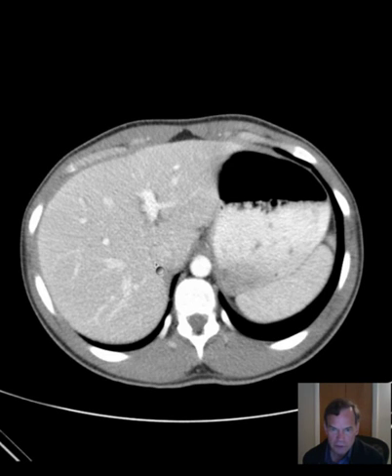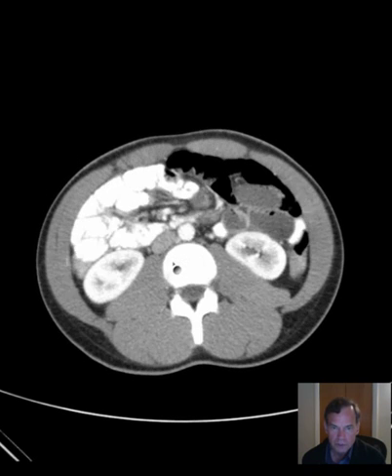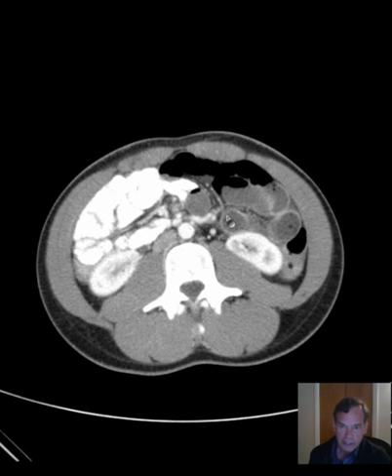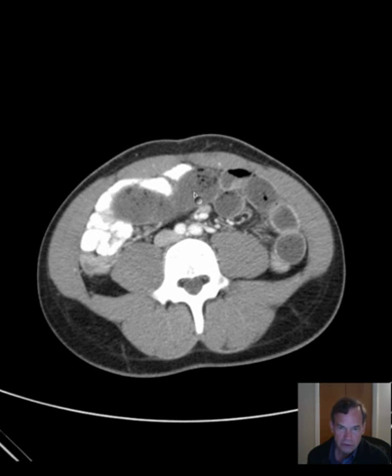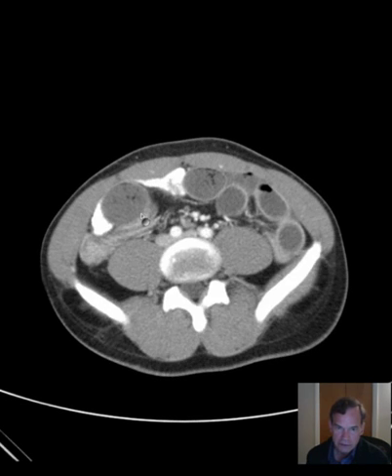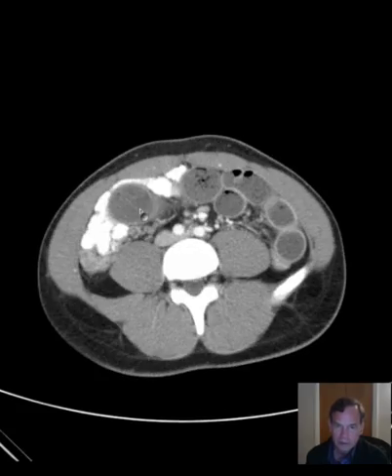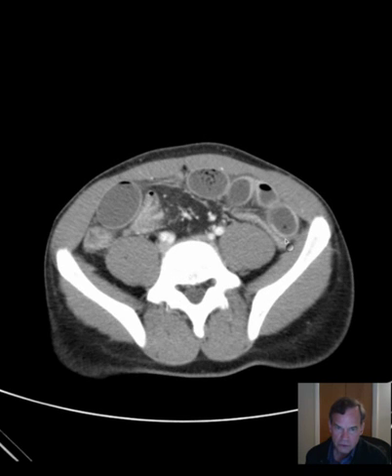And the lung bases are clear. We would put this on lung windows to get a better assessment. So what do we have then? We have abnormally dilated bowel in the left lower quadrant, extending a little bit across the lower abdomen to the right. So it's dilated bowel.